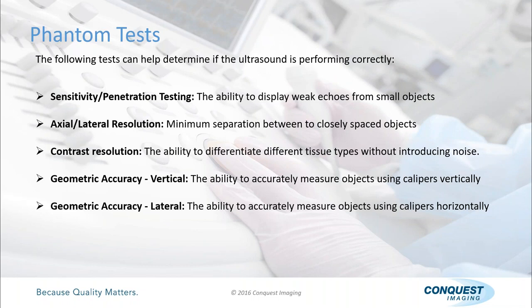It's kind of subtle, but it is, and we use frequency as a guide, but in reality, when you get to real detailed stuff, the lowest frequency may not give you the best penetration for the small objects.